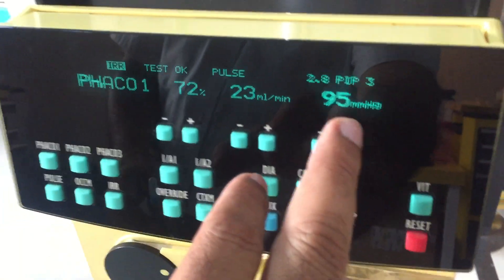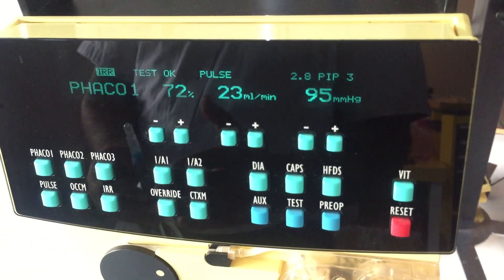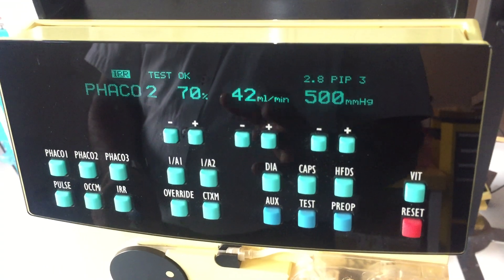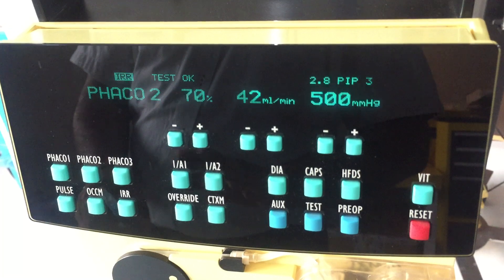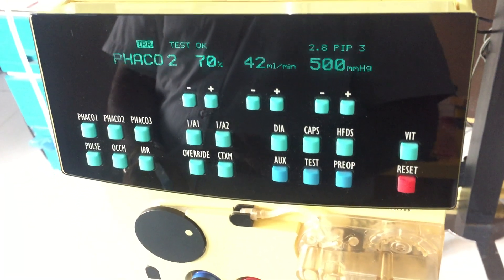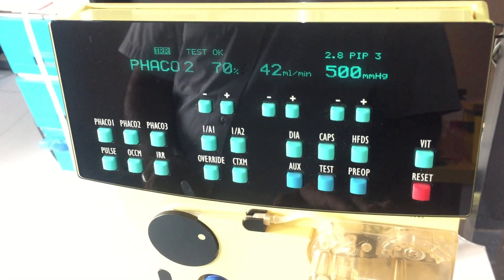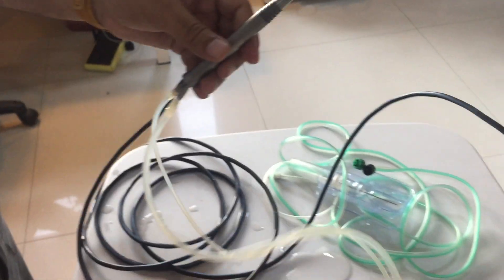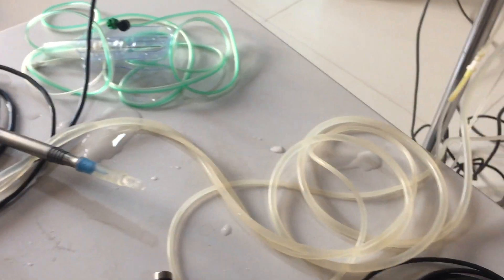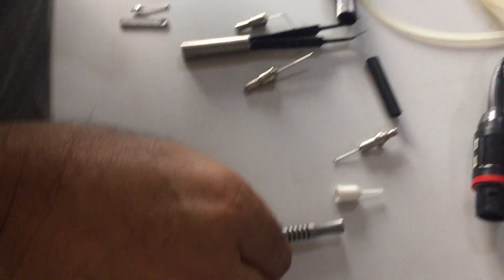The system automatically goes to phaco one. This phaco one setting is for sculpting — for breaking the nucleus into two or three pieces. Then you press the button phaco two. You can also change between phaco one, phaco two, and phaco three using the foot pedal in the right horizontal direction. Your system is now ready for phaco.